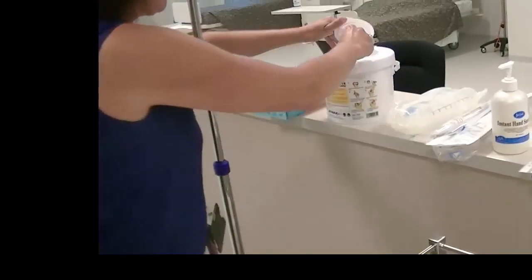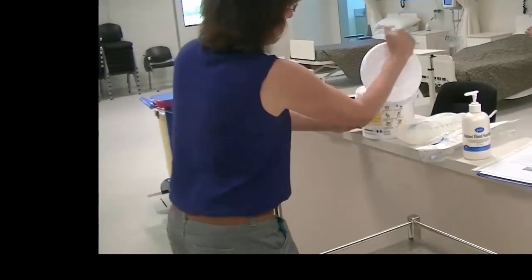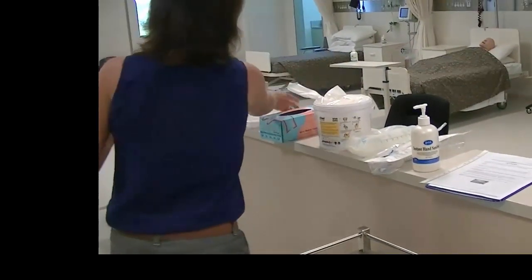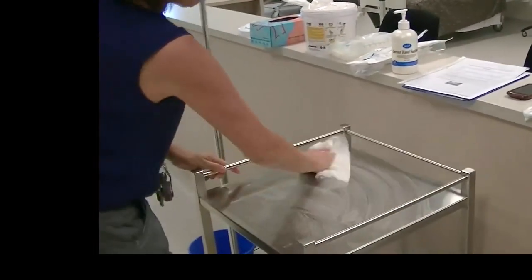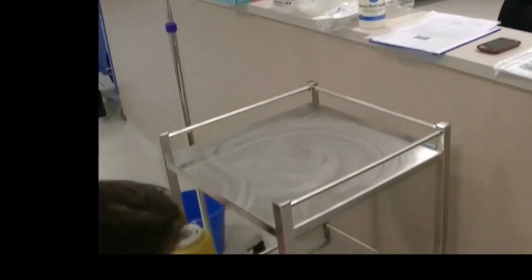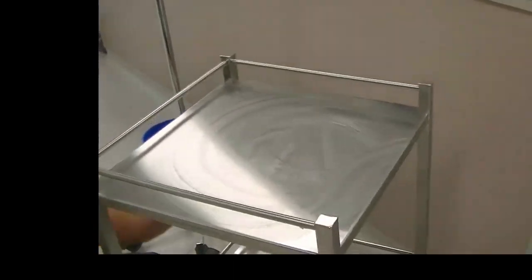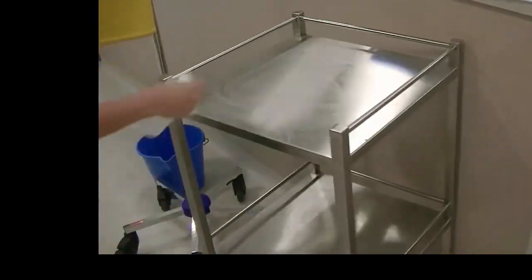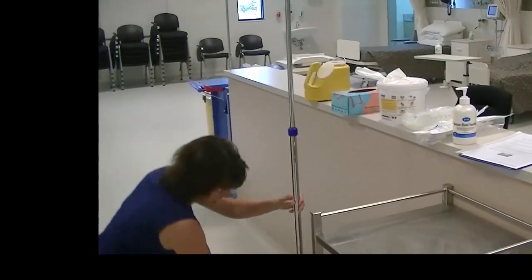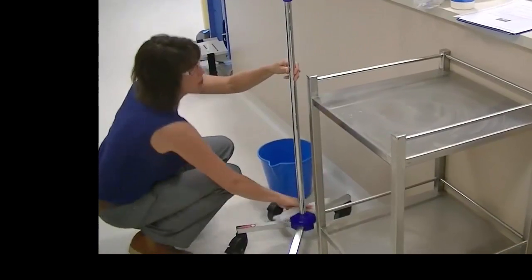First of all, I'm going to clean down my trolley because I need to have a clean surface to work on. There we go. So just give it a quick clean, get all the muck off. And I'm going to also just make sure my pole's clean too, because it can get a lot of splash on it and it goes between patients.